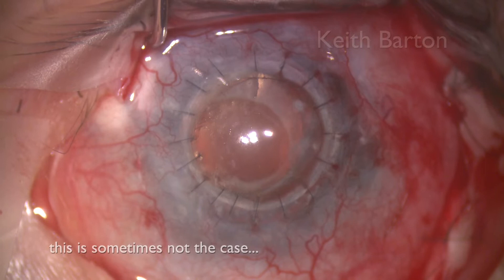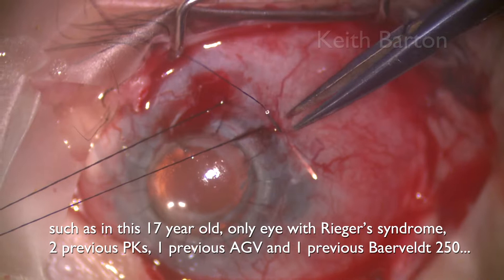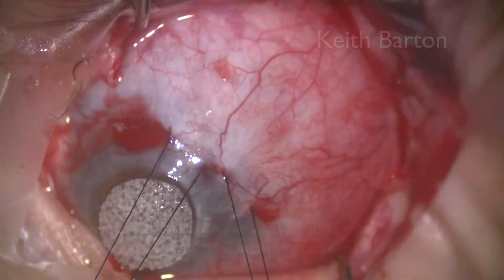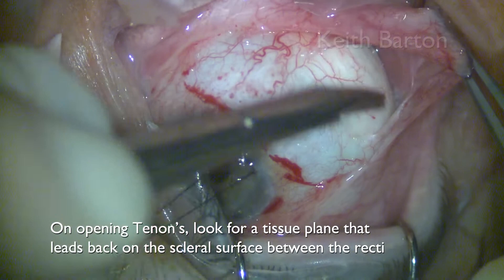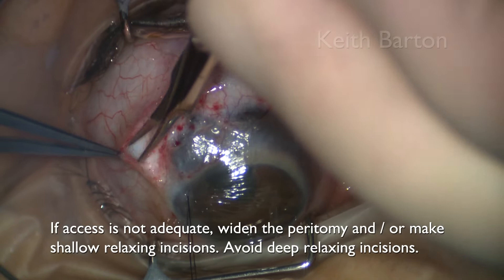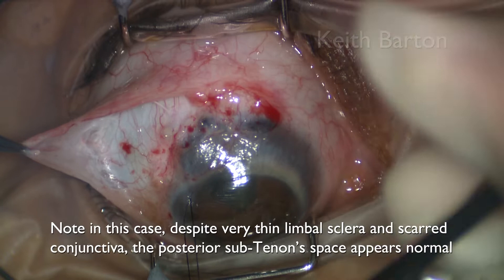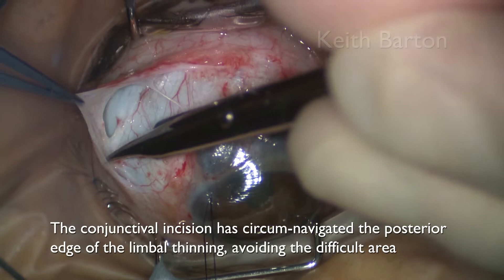This is sometimes not the case. In this 17-year-old only eye with Rieger syndrome, two previous PKs, one previous Ahmed valve, and one previous Baerveldt 250, two traction sutures inserted into the thin limbal sclera provide access with less traction on each than with one solo suture. On opening Tenon's, it's important to look for a tissue plane that leads back on the scleral surface between the recti. If access is inadequate, widen the peritomy and/or make shallow relaxing incisions. Avoid deep relaxing incisions to overcompensate for a peritomy that's too narrow. Note in this case, despite very thin limbal sclera and scarred conjunctiva, the posterior sub-Tenon's space appears normal. The conjunctival incision has circumnavigated the posterior edge of the limbal thinning, avoiding the difficult area.